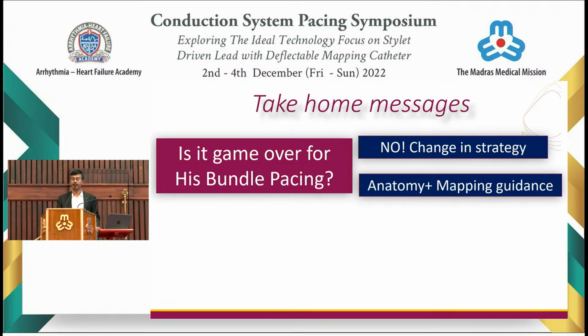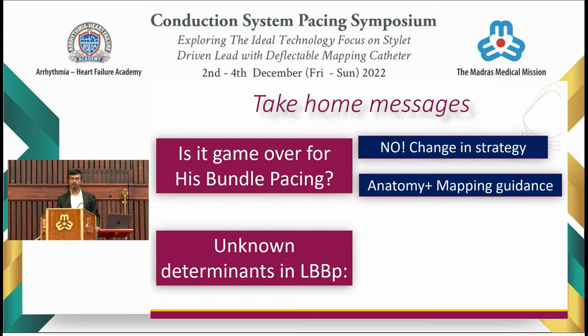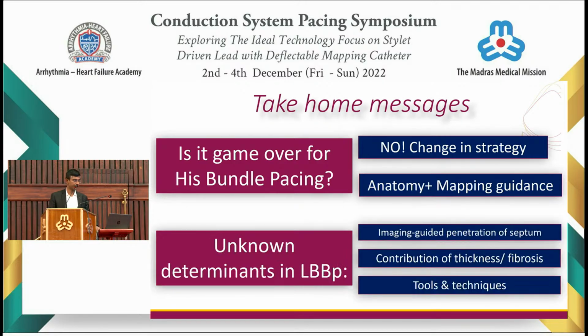That will help us take this field forward as far as His bundle pacing goes. There are a lot of unknown determinants in left bundle branch pacing. Again, image-guided penetration of the septum could be considered an important tool. We do not know the contribution of the thickness of the septum or the fibrosis of the septum to the failure rates. Tools and techniques are evolving.